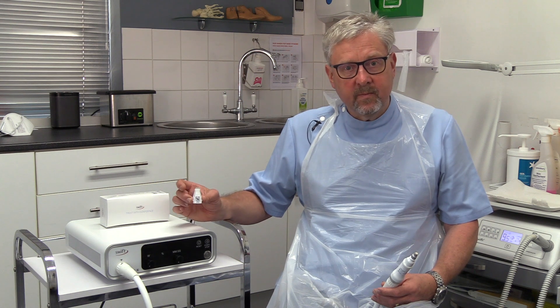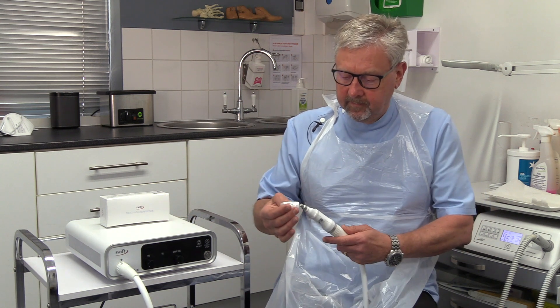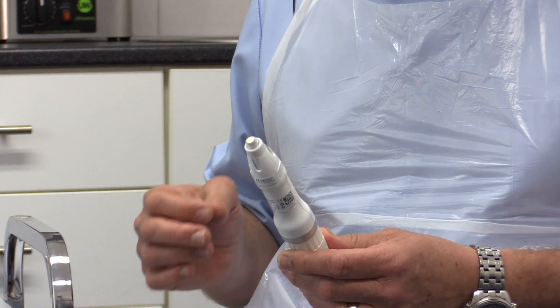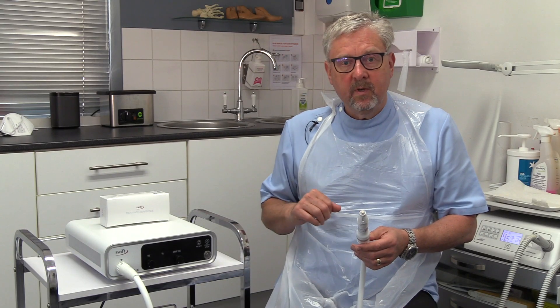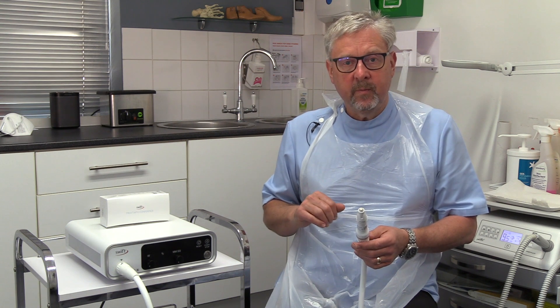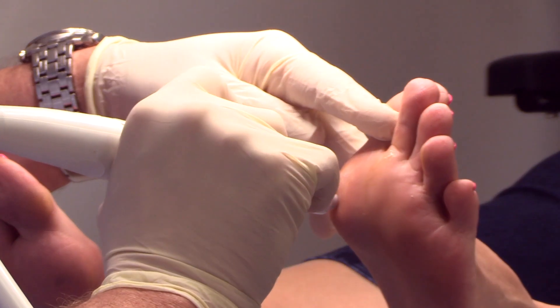Each patient has a fresh tip applicator, and each applicator lasts for fifteen minutes. This means that when using Swift, you can treat as many sites as you can manage within that fifteen minute period. So if somebody has multiple verrucas, we can treat multiple sites.